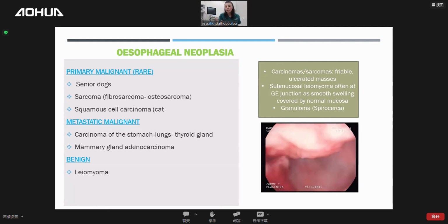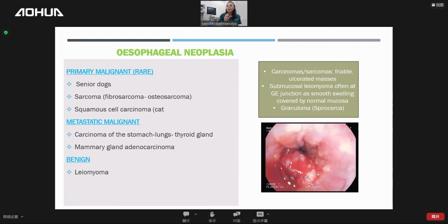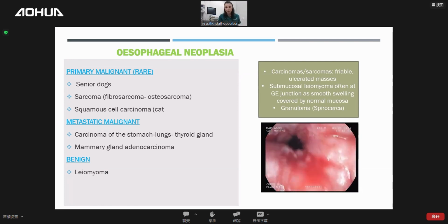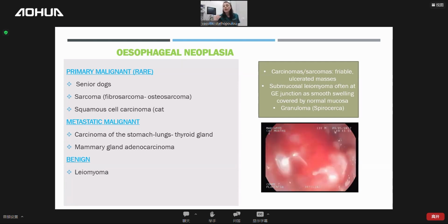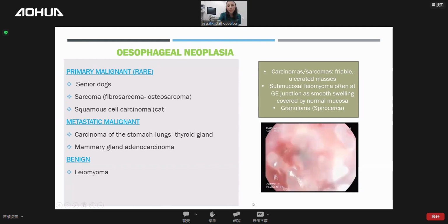and we biopsied this and it was sarcoma. And no, actually this was squamous cell carcinoma in the cat. And you can either put a relief stent, but it's only going to be for a while, up until the proliferative tissue goes through the stent as well. Or you can put a PEG tube in order to preserve the body condition score of the animal. This was a very, very nasty case. Otherwise, you don't have any other choices in these patients. You will euthanize them.